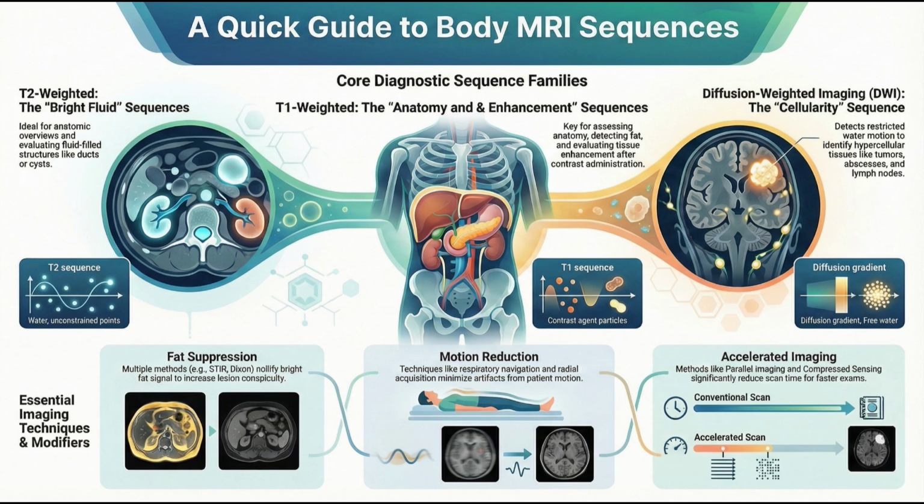Exactly. The quantitative values are just crystal clear. A normal liver is around 2.3 kPa, advanced fibrosis is maybe 4.8 kPa, and cirrhosis can be up at 13.0 kPa. It's an objective, non-invasive measure of their disease stage.